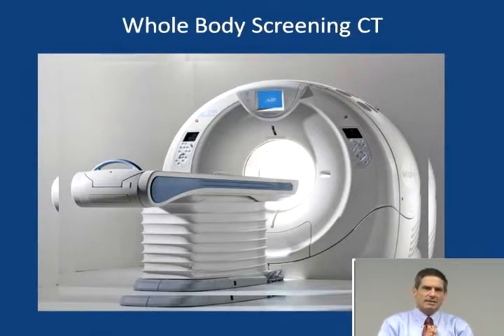Now, one of the things to keep in mind when you're dealing with incidentally discovered lesions is that the CT functions as a kind of screening tool for whatever body part is scanned. And indeed, many entrepreneurs have opened up centers for CT screening to evaluate asymptomatic or basically asymptomatic patients, looking for occult but significant disease. This practice has engendered a lot of interest on the part of the press and the lay public, but it's not approved by the FDA.